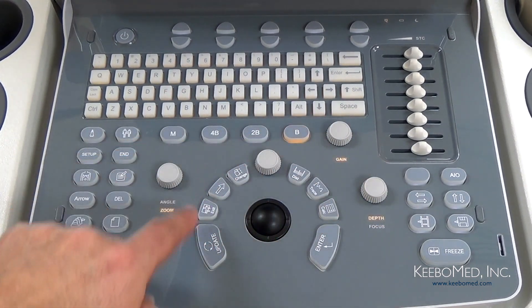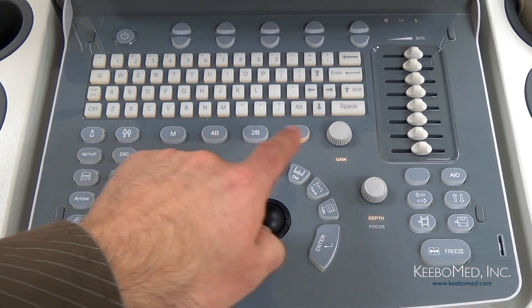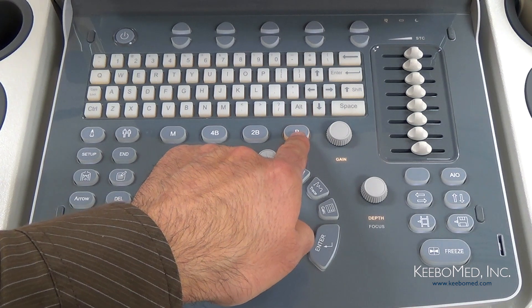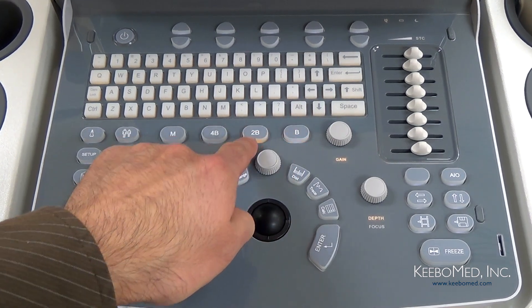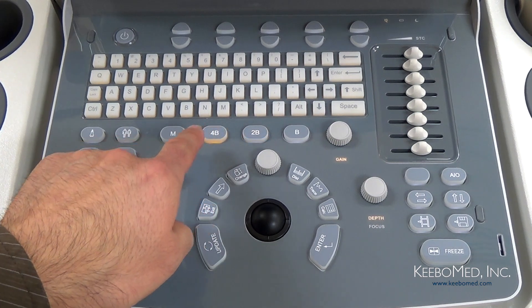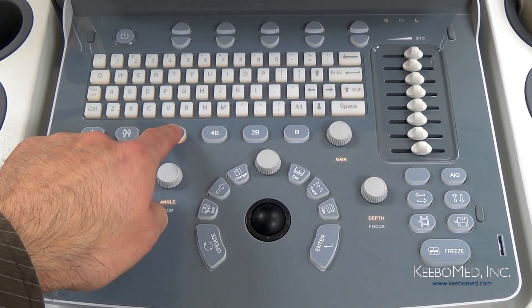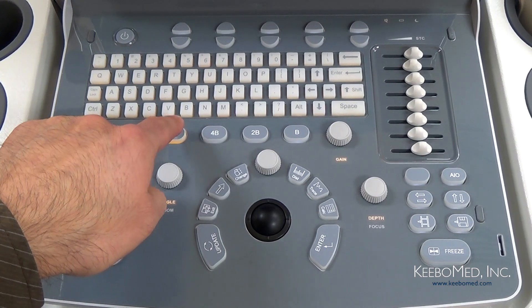Above the center group of keys there are different imaging modes. First we have B mode, then BB mode, next to that 4B mode, and finally M mode, which can also be switched to BM mode.